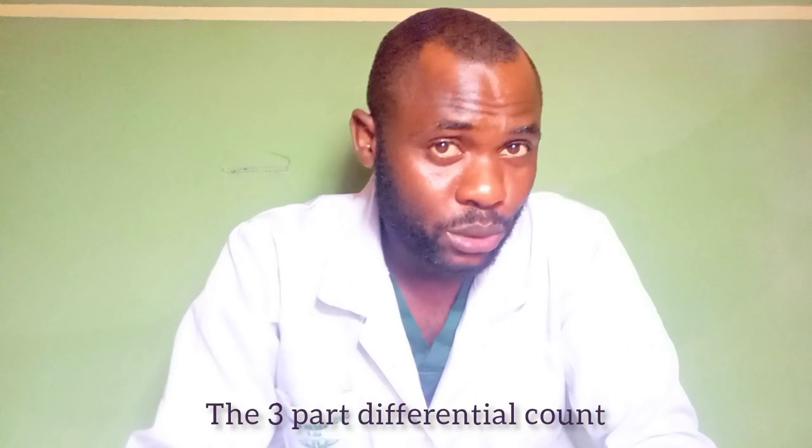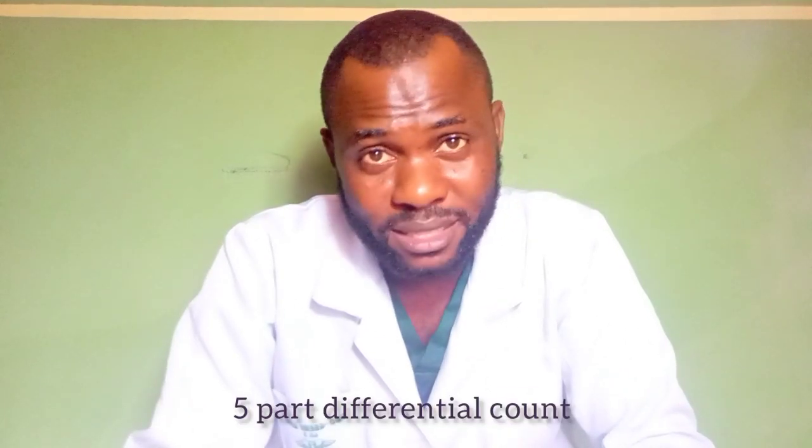So again, there are also two types of hematology auto analyzer based on the white blood cell differential count. That is the 3-part differential count and the 5-part differential count. So quickly we'll be looking at the differences between the 3-part and the 5-part hematology auto analyzers.